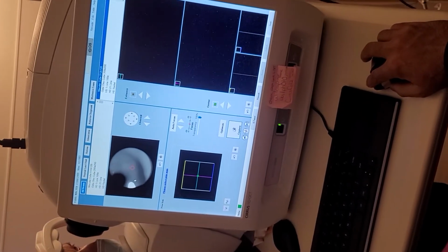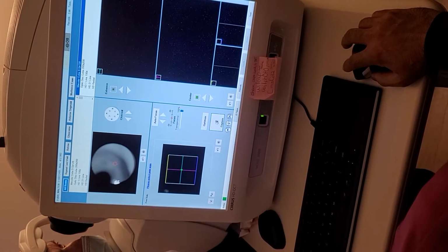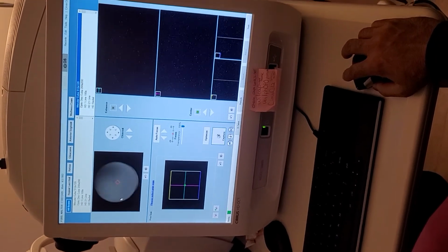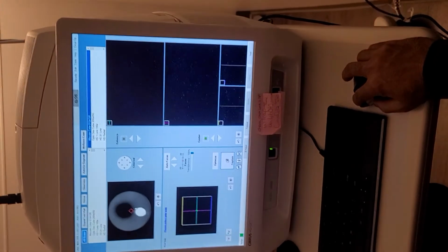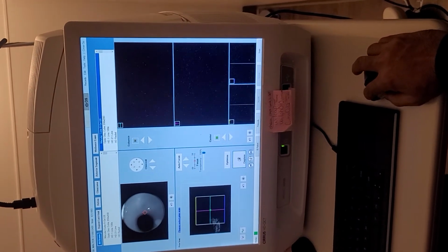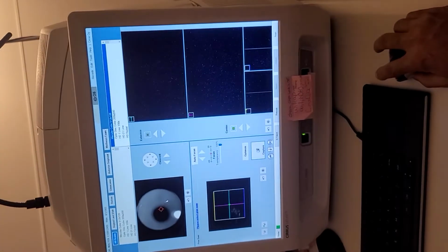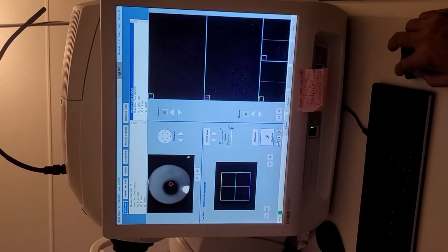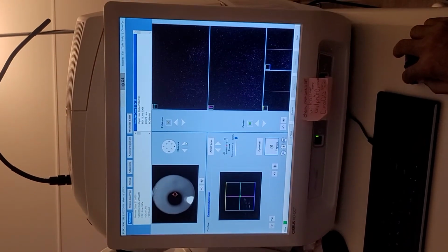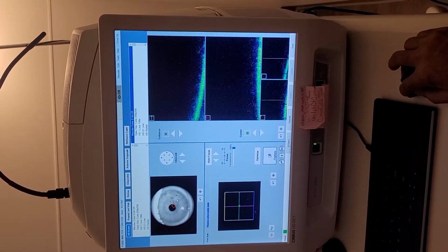And then we wanna make sure that his head, so move your head a little bit to your left, like straighten up your head a little bit. Did that make a difference? Yeah, okay. Because he was kinda like this. I mean, it wasn't totally like that, but it was pretty close. Okay, good. It's so cute.